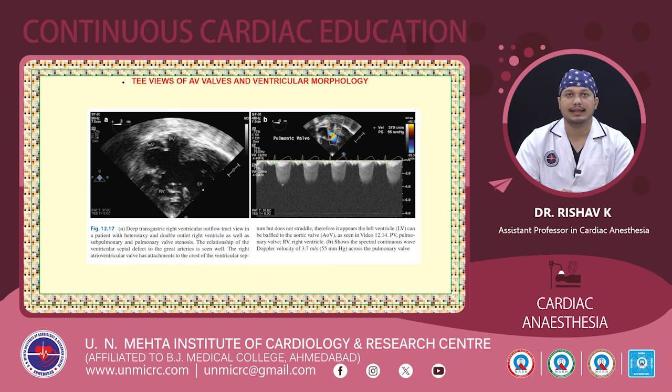Now coming to the next set of images, where we are seeing a deep transgastric right ventricular outflow tract view in a patient with heterotaxy and double outlet right ventricle as well as subpulmonary and pulmonary valve stenosis. And here we can see the relationship of the ventricular septal defect to the great arteries. Also, we can see the spectral continuous wave Doppler velocity across the pulmonary valve in the image on the right side.